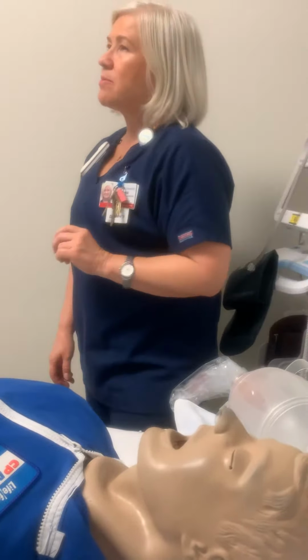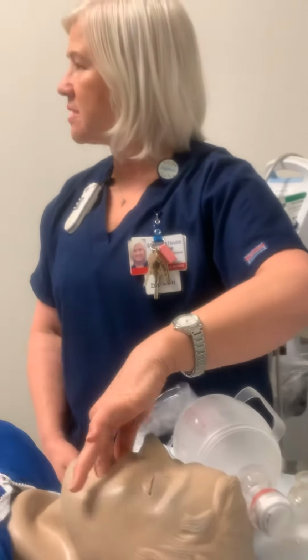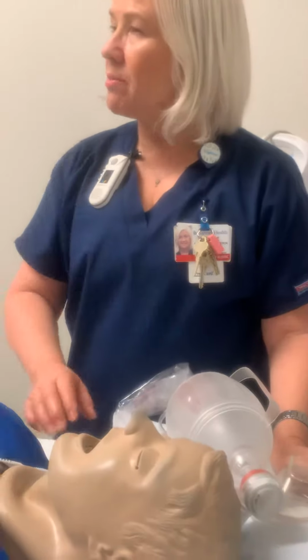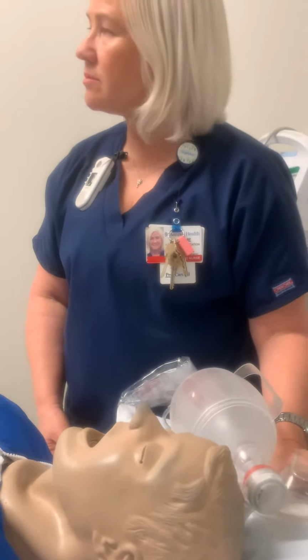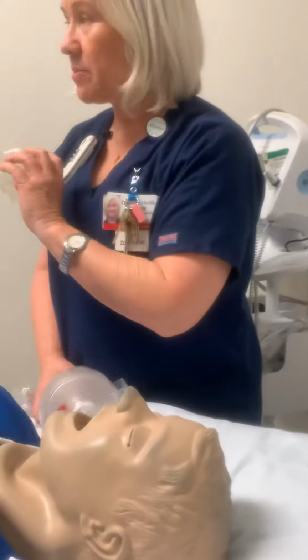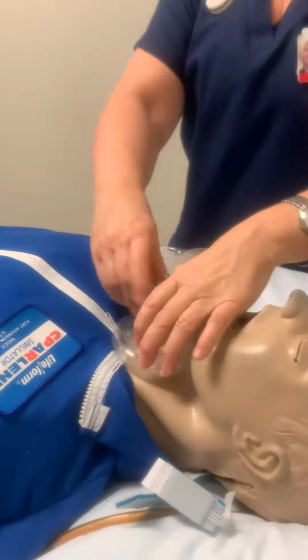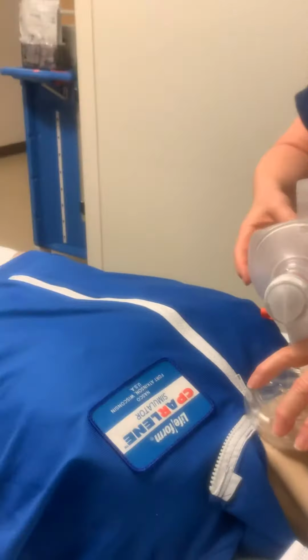If I have a patient who needs to be ventilated at their stoma, and let's say they've got a lot of stuff up in here and it's hard to ventilate them up here, I can still ventilate them at the stoma. But how am I going to do that? Thank you. Yep, and I don't have a pediatric mask, so if I were to use this on me, do you see how I'm not going to get it? I don't care if you put my head all the way back, you're not going to get a good seal. That's why we have to use a pediatric mask. I don't have one here, we only have a couple at Gateway, and then I'm going to ventilate them here.